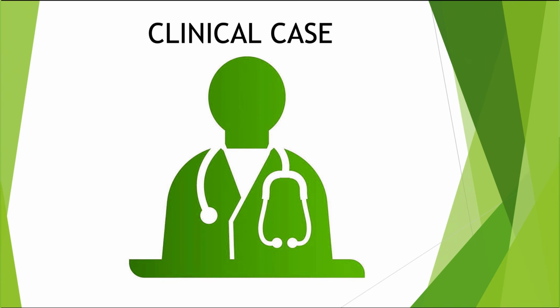Be sure to watch the video all the way to the end because I made 2 slides for you, summaries that really cover the main criteria. The first slide is about the positioning from the video. The second one sums up the latest measurements from professional guidelines, at least here in France, about whether it's well positioned or poorly positioned. All right, I'll leave you now with this training video.